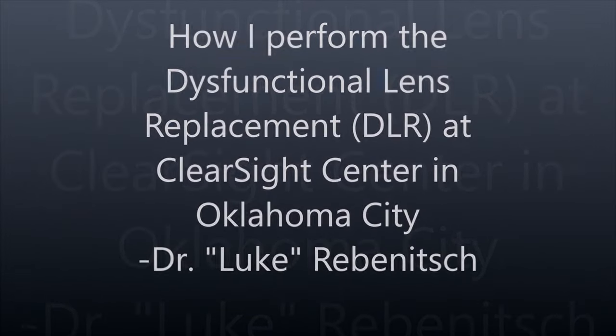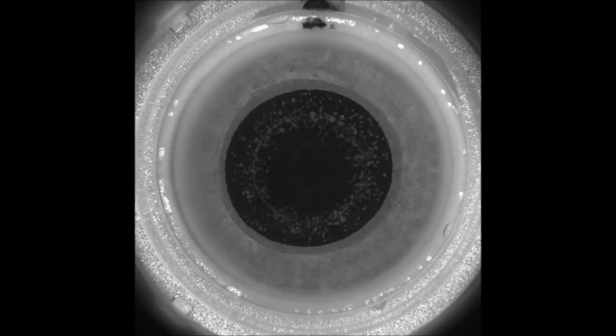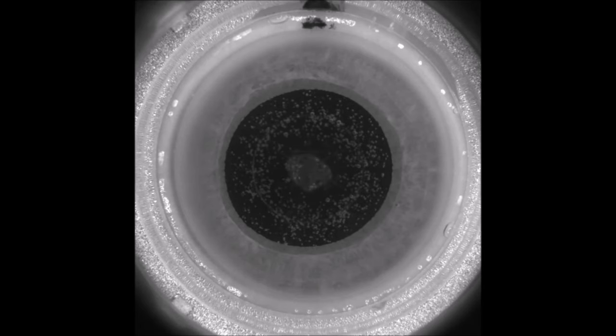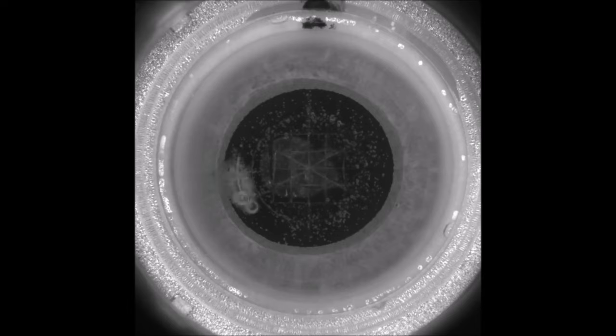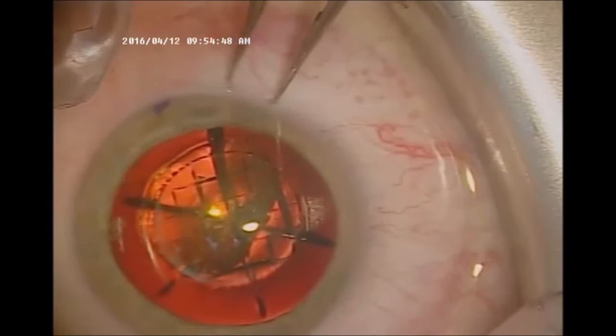This is how I perform the DLR. First we start by using the femtosecond laser to create the capsulotomy, followed by the fragmentation of the crystalline lens. Now, after the fragmentation, we correct the astigmatism, and we move on to the operating room.